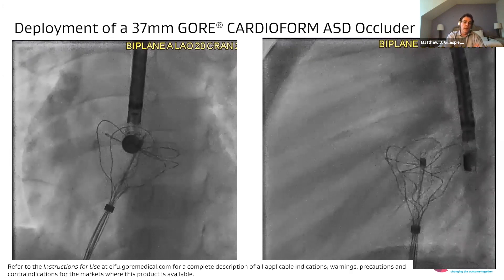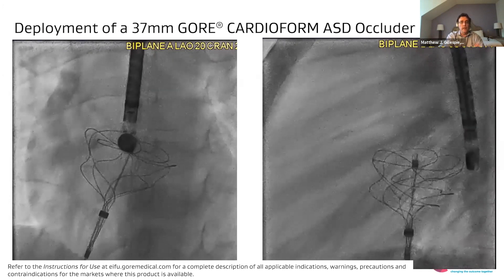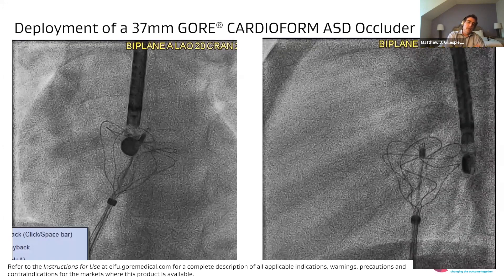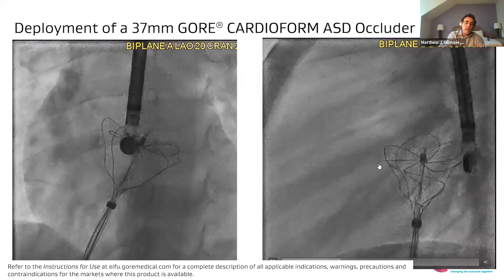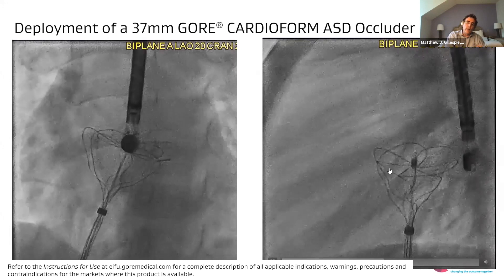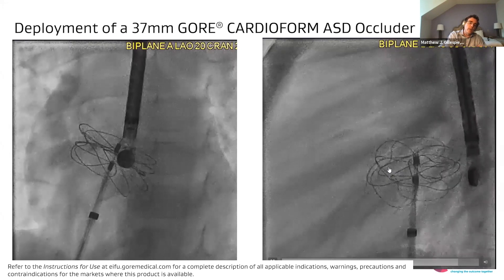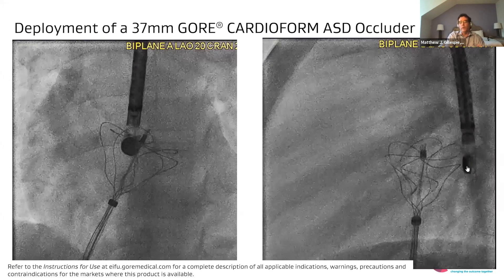I agree with the choice of a 37 millimeter device here. As I watch your left hand panel, you have backward tension on the LA disc and you're pushing out the RA device. It looks to me in the left hand panel — I can't tell on the right hand side if you've come through or not. So it looks to me that maybe you're all in the LA, although I can't tell for sure.